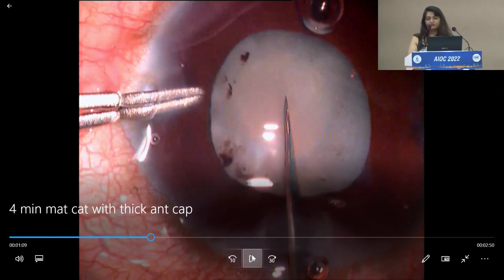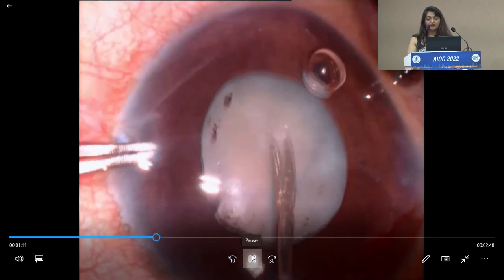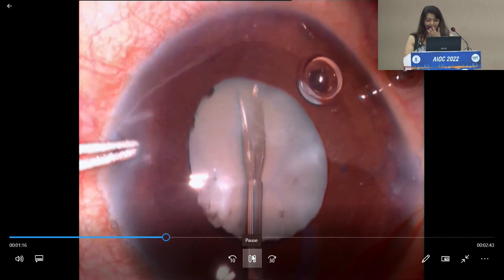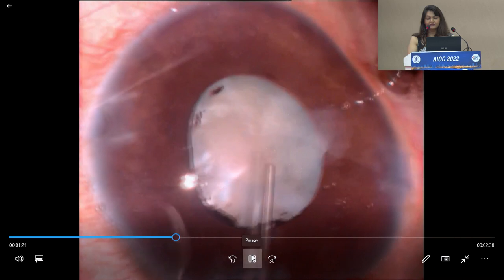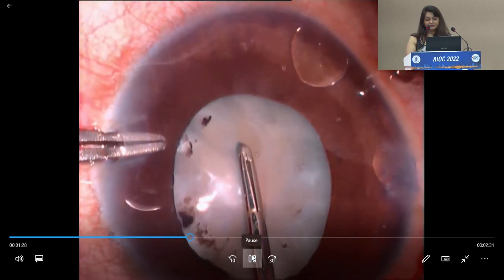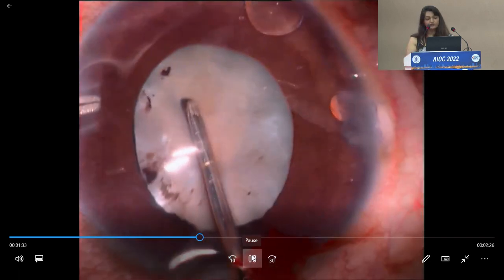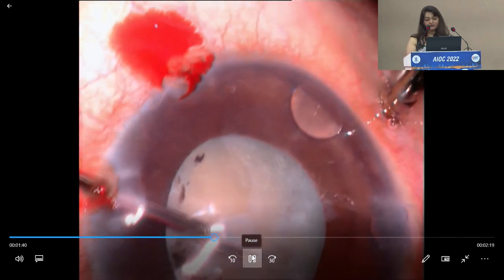As I was saying, I was trying all the maneuvers with the scissors and MVR blade to make some kind of an opening, and I kept trying again and again with the same forceps. To be very frank, at that point, this is an edited video, but I was very, very tired and I was not understanding what to do. At some point, I got the opening, removed a little bit of fluid and started my rexis with the forceps, and I realized that it was not moving at all. So I decided to go ahead with the scissors. I cut a bit and continued pulling it with the forceps, and again it was not happening.